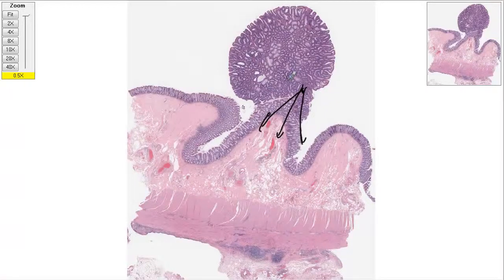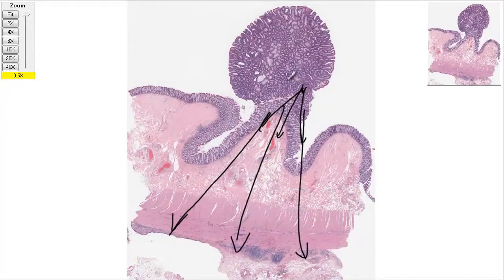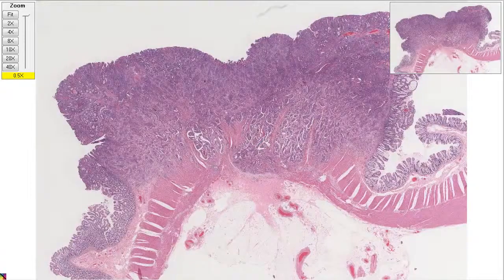In this case, it grew all the way through. Wow, and so you can see the scale. It not only grew a little bit, it went right through the muscle. Okay, so going back to this one here, this is now... There are some things the body has to fight this off, but it was unsuccessful.